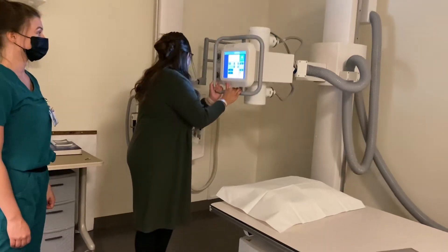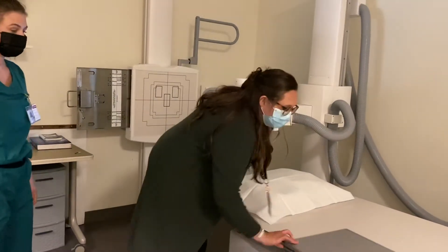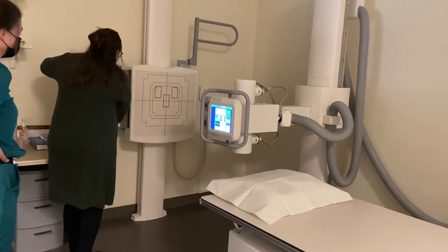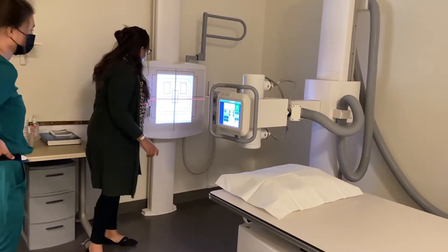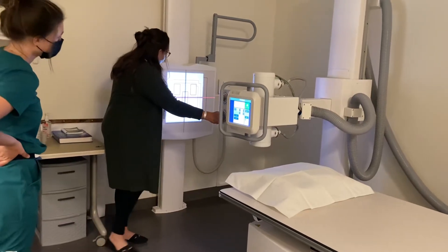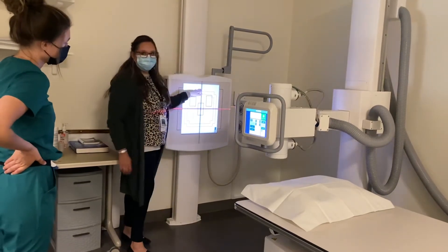I'm going to put my IR in my bucky. I want to use a lengthwise 14 by 17 for my patient, so I'm going to put that in lengthwise and ensure that I'm collimated to 14 by 17 lengthwise. I'm going to put my left marker in the bottom left-hand corner to keep it out of the diaphragm.